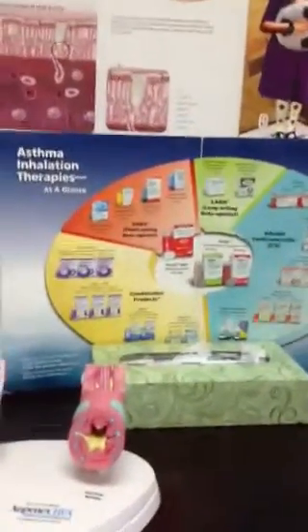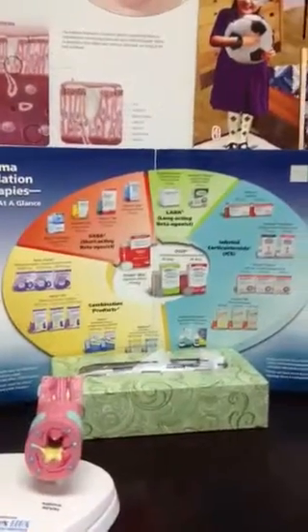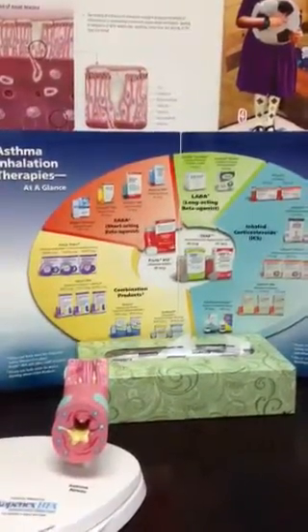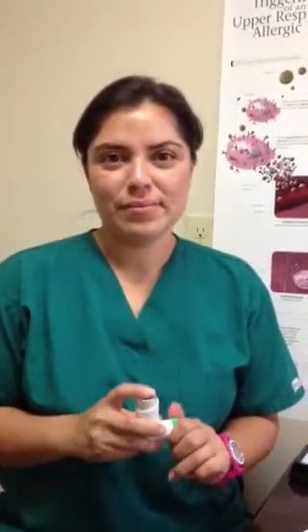So this is a recent poster of all the different types of inhalers that are available on the market today. We're going to talk about just a generic inhaler and the correct technique. With us we have Naren today. Naren has been training patients for many, many years in the correct use of inhalers, she probably has seen it all, but she's going to talk to you about how to do it correctly.